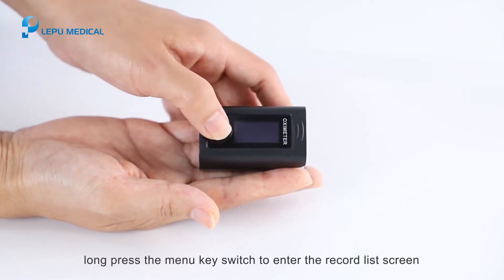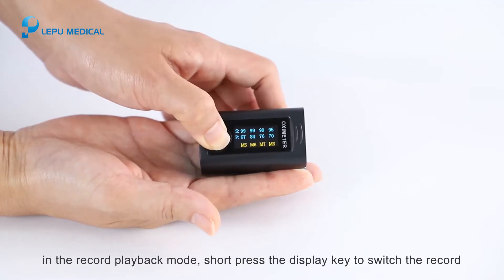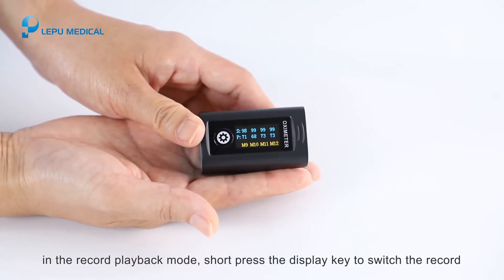In the off state, long press the menu key to enter the record list screen. In record playback mode, short press the display key to switch between records.